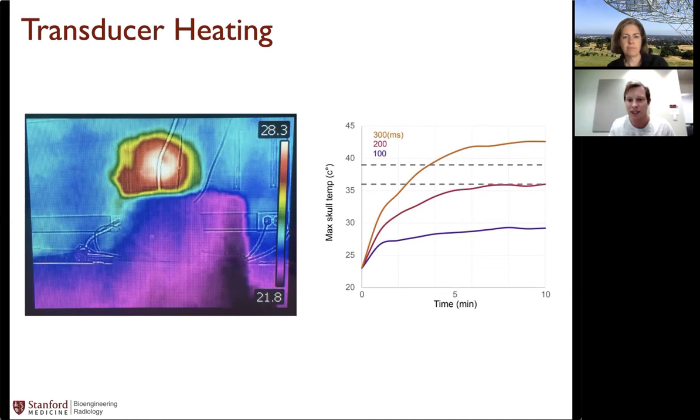So if I was at 100%, this effect would be very quick. So what I did here was look at different duty cycles down to 10%, where I'm virtually not changing the brain temperature in any normal way. So at 100 milliseconds here, the change is so far below the normal brain temperature anyway that it's unlikely to have an effect on neural activity. So just something to consider. This probably wouldn't have an effect if your transducer was at a distance from your prep and you had a large volume of coupling agent. But again, something to think about. And Kim, you can comment on this.